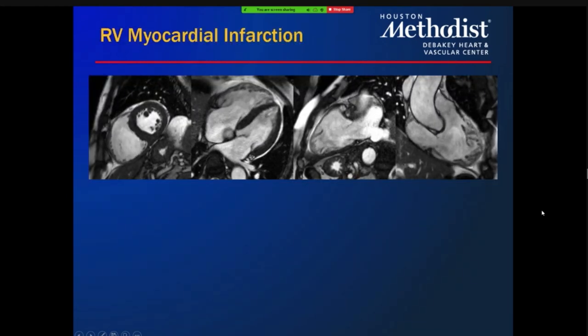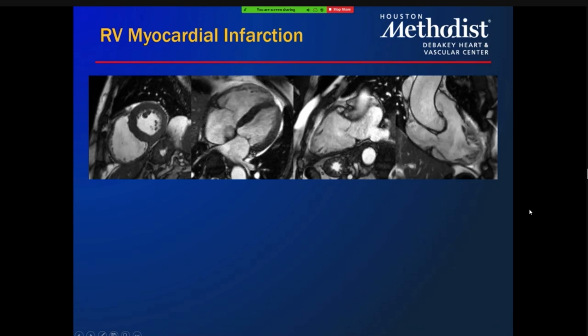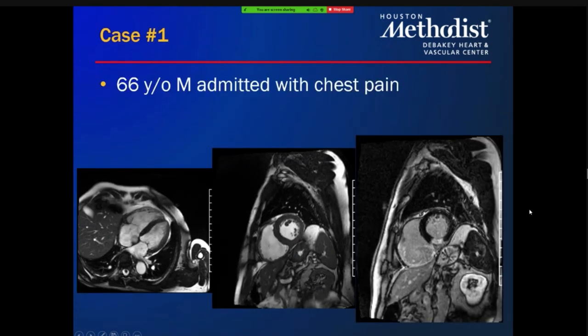And this is just showing more of the same. Eric, did George also comment on the papillary muscles? No, he did not. But yes, you are correct, Dr. Shaw. You can actually see the posterior medial papillaries on the cine, but then they kind of disappear on the LGE. Dr. Shaw, that's indicative of papillary scarring, papillary involvement. So papillary infarct for sure.